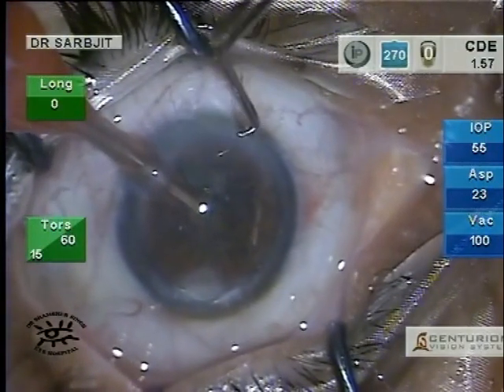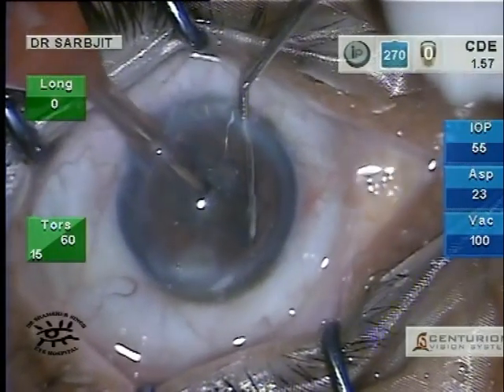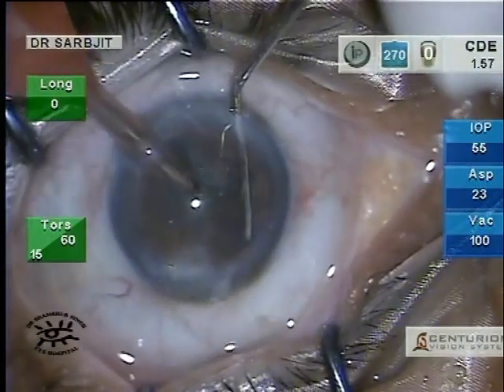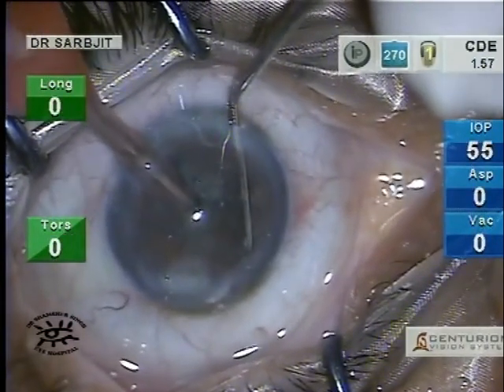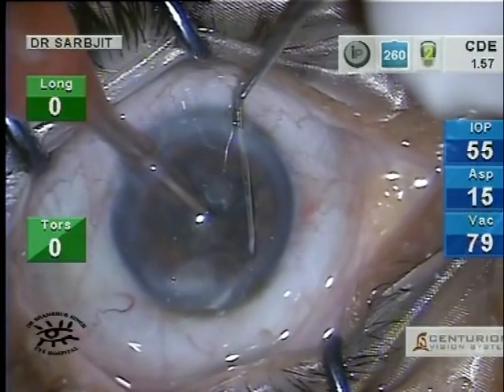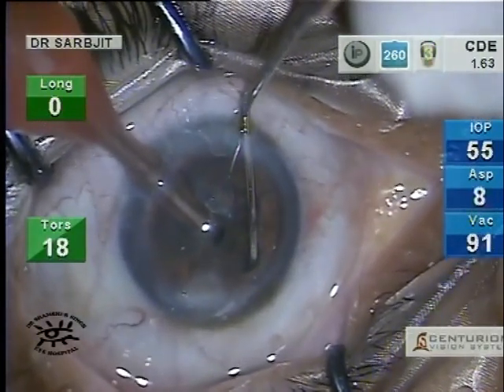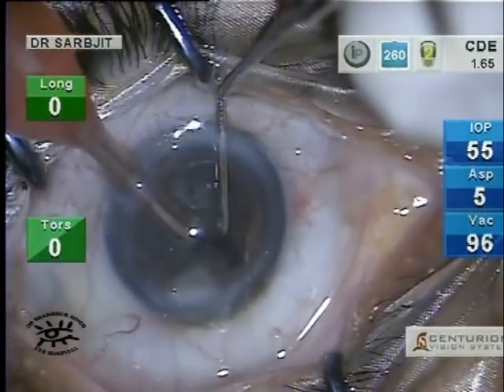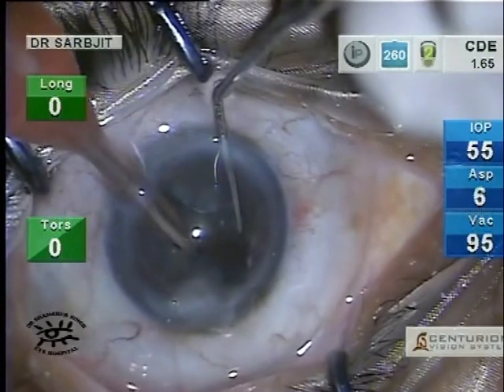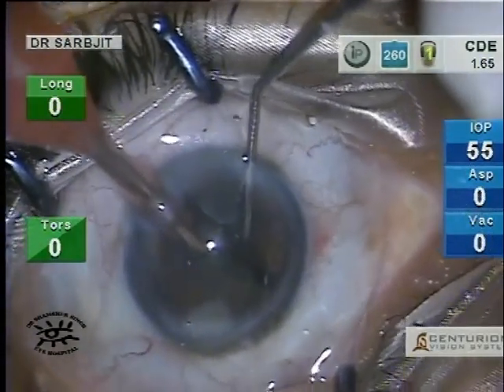Then the chop portion of the stop and chop happens. You'll notice I haven't changed my parameters — they stay the same as for sculpting. The vacuum doesn't go beyond 100 because this is a soft cataract, and if the vacuum goes higher there's always a danger of going through the lens and the posterior capsule.